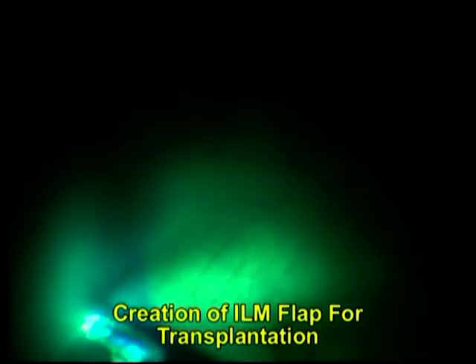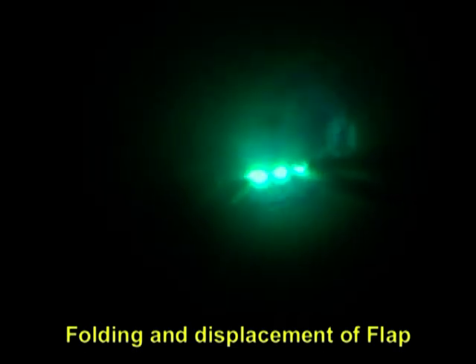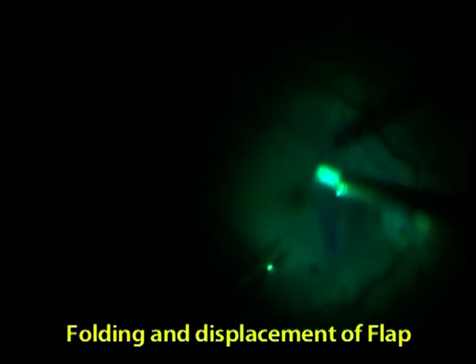Unfortunately the ILM flap detached, so the surgeon opted for Plan B and took out an ILM piece and placed it over the hole with the help of colored viscoelastic. After this, fluid-air exchange was started, and just near completion the surgeon found the ILM flap was displaced from the hole and rolled over.